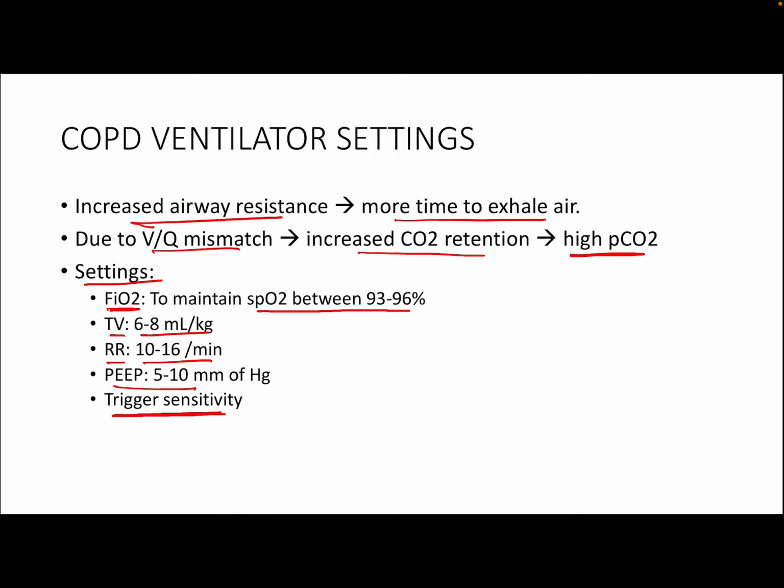Trigger sensitivity is the cutoff value of, it could be either the airway pressure or it could be a cutoff value of a flow. And once that cutoff value is reached, that is when the ventilator triggers a breath. That is a trigger sensitivity.